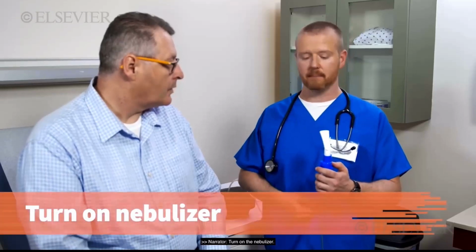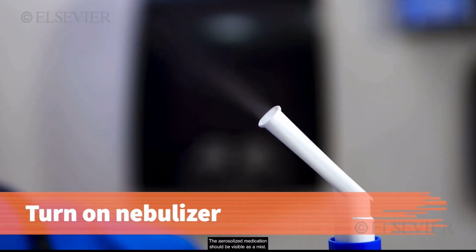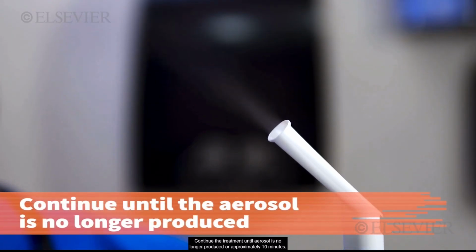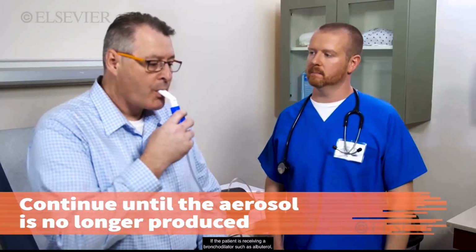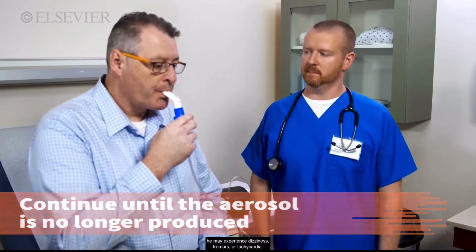Turn on the nebulizer. The aerosolized medication should be visible as a mist. Continue the treatment until aerosol is no longer produced, or approximately 10 minutes. If the patient is receiving a bronchodilator, such as albuterol, he may experience dizziness, tremors, or tachycardia. Continue the treatment unless otherwise ordered by the provider.